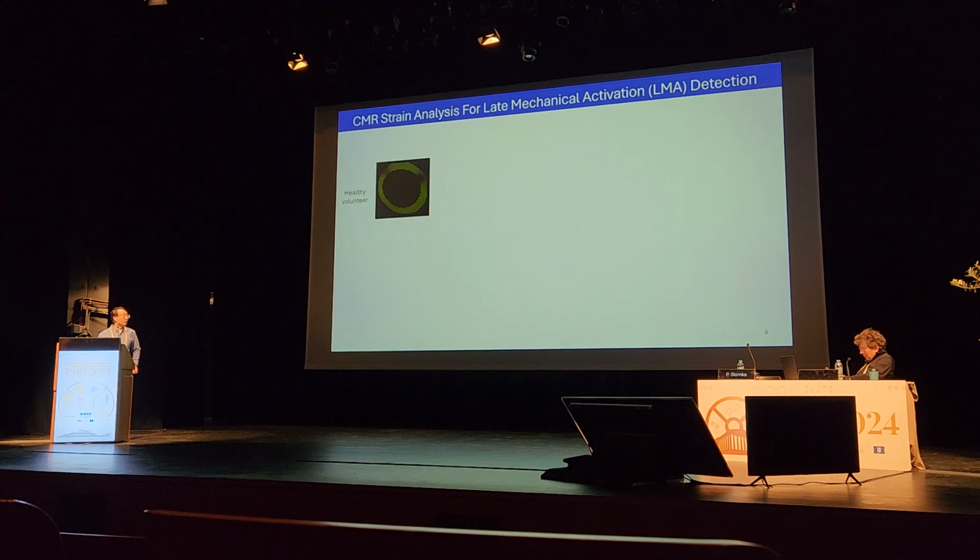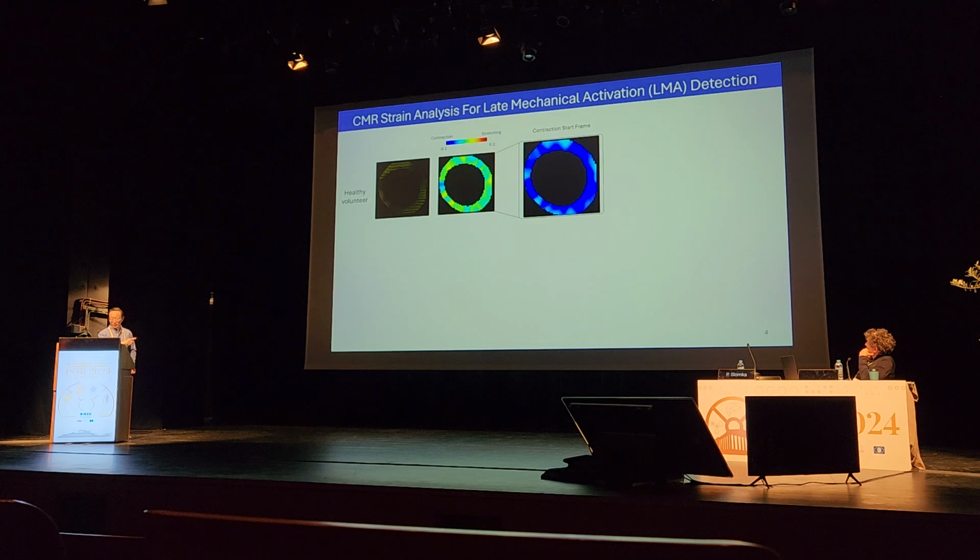Let's first look at the motion video from a healthy volunteer. We can observe that when it contracts, every location along the myocardium starts contracting at the same time, simultaneously, right? That's a healthy person. And it can be even more easily identified from this video of circumferential strain. You can see that the blue means contraction, and everywhere it turns blue at kind of the same time, right? And here's a particular frame from the contracting start time, and you see all blue, or all contraction.